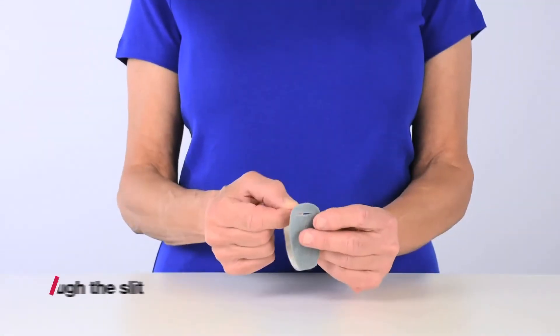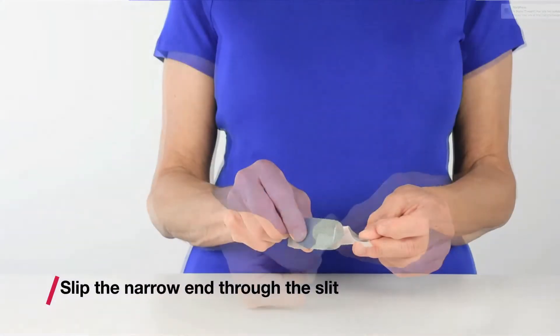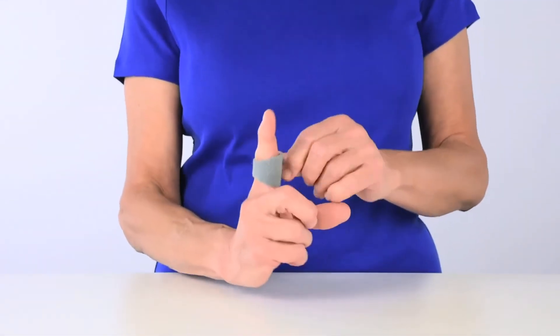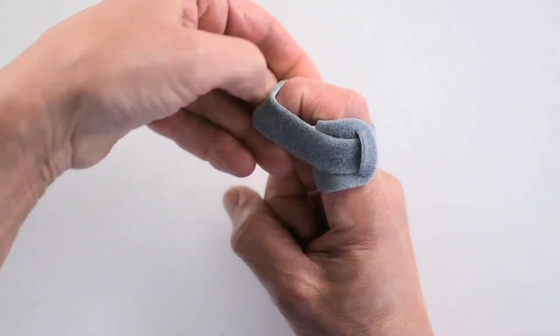First, start by threading the narrow end of the final flexion wrap through the slit in the wide end. Slide the strap on with the wide section on the palm side of the finger and pull the strap around the base of the finger.